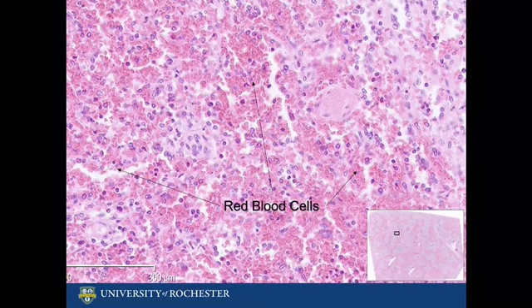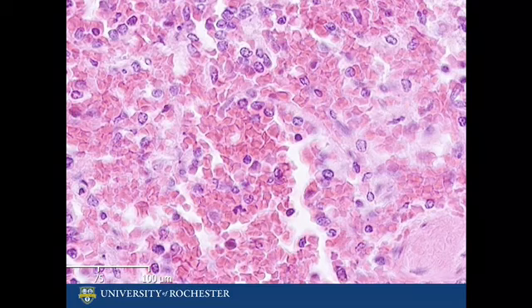Red pulp consists of a network of blood vessels that act to filter and store blood and its constituents. Specialized capillaries called sinusoids have specifically sized gaps in their vessel walls which act as a filter. As blood flows through the sinusoids, red blood cells are squeezed through the vascular gaps. Old or unfit red blood cells that are damaged by the filtering process are consumed by the abundant macrophages and other monocytes that reside in the red pulp.